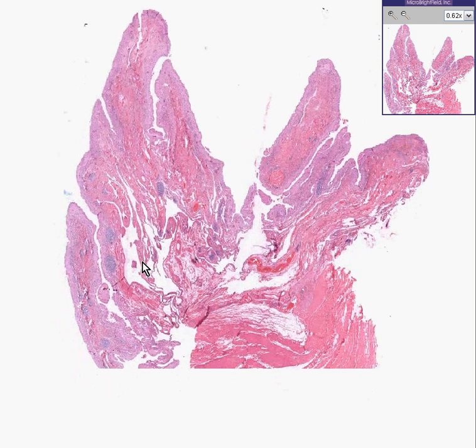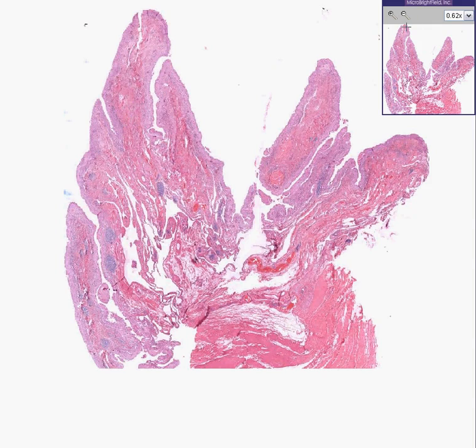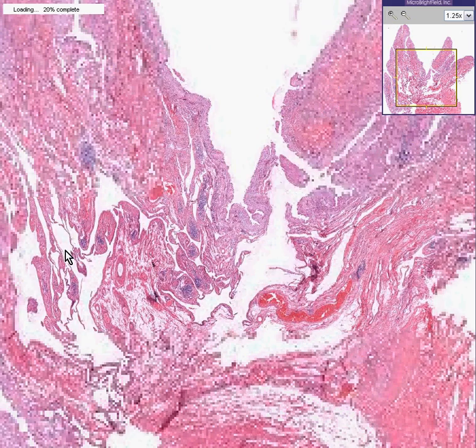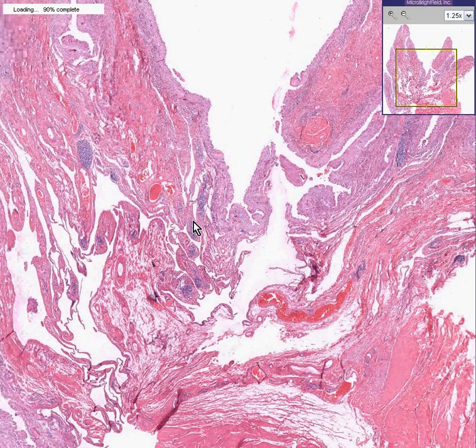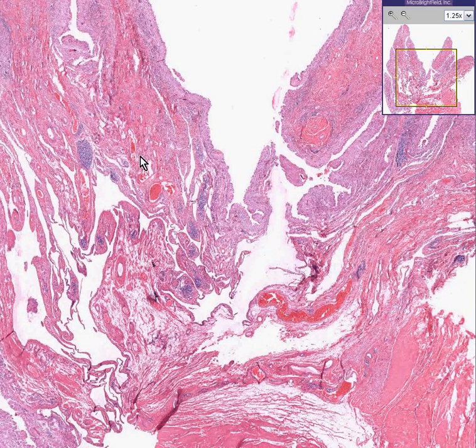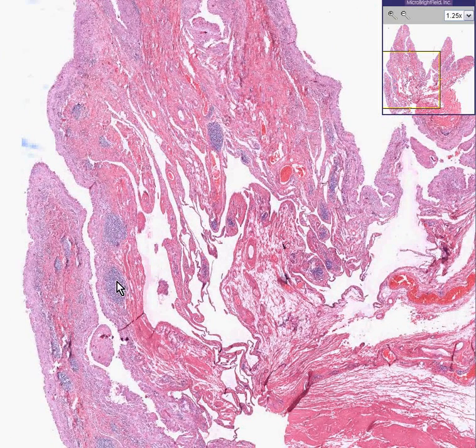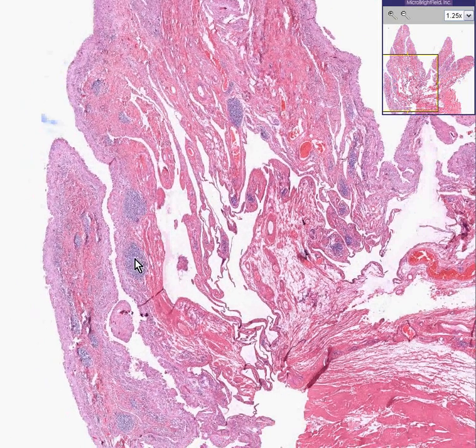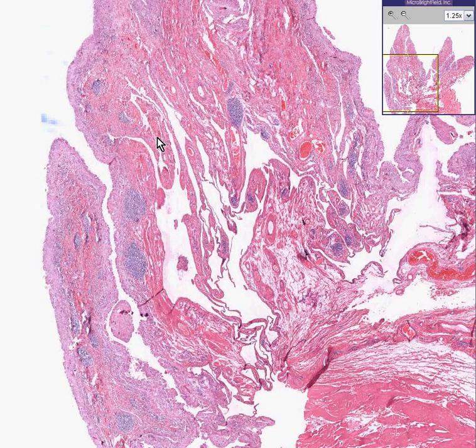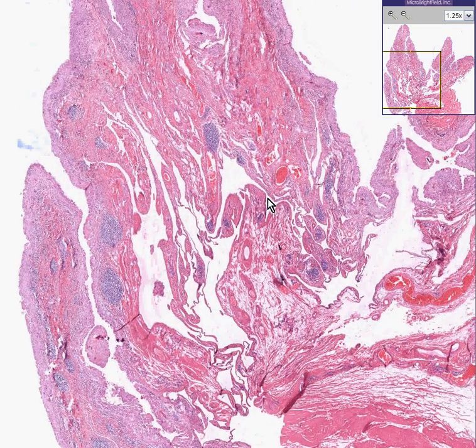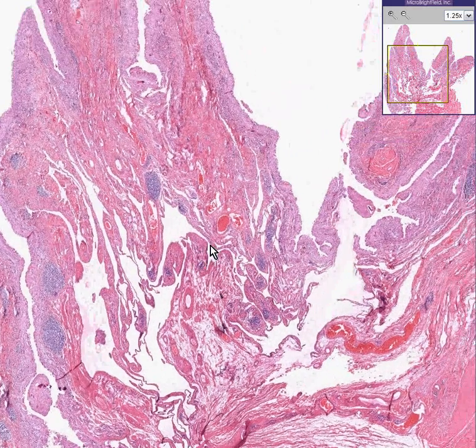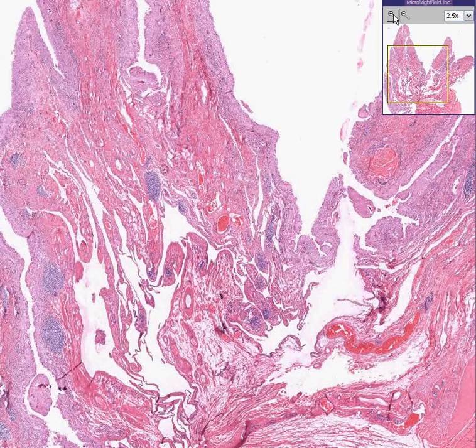Here is some synovium. Not only is it proliferated to the point where it's forming somewhat of a papillary configuration, but you can also see extensive hemorrhage within it, as well as infiltrates of chronic inflammatory cells, as well as lymphoid follicles. With time, this can become more fibrotic. And in the acute phases, it can also be very necrotic as well.